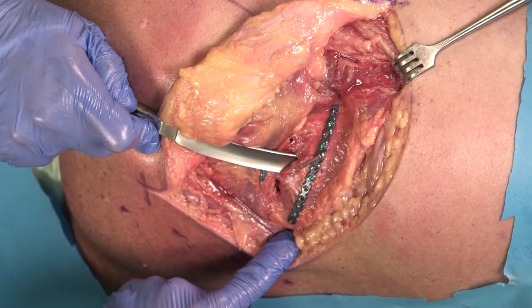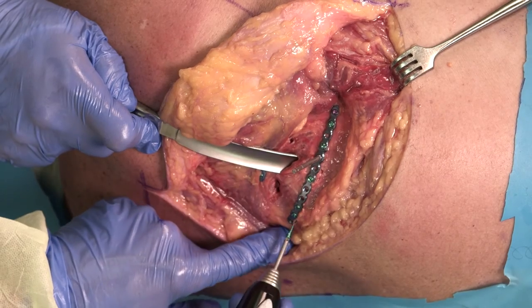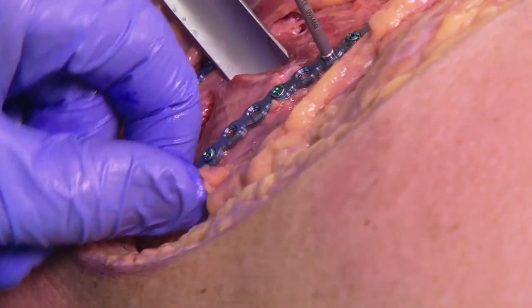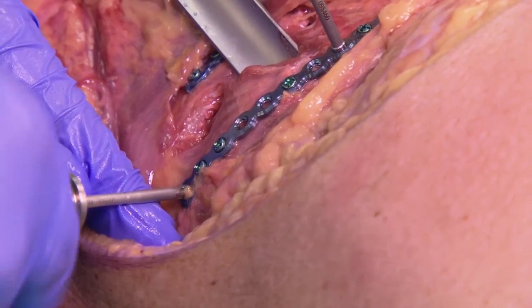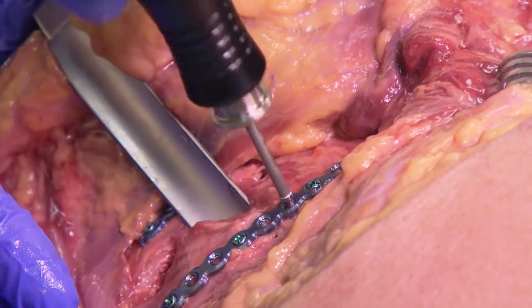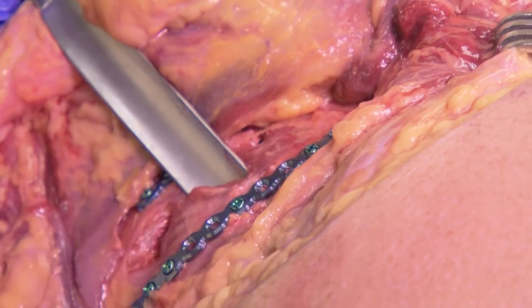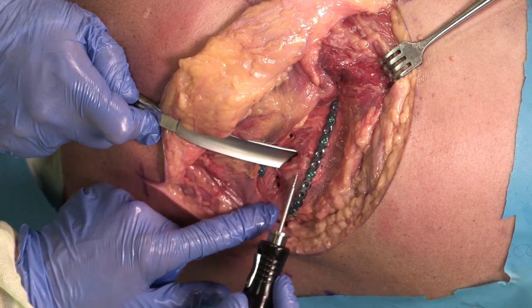A final screw will be placed into the hole. To finish the construct, in this instance with such a long lever arm, three screws will be used in the posterior aspect plus one additional screw to complete the construct. Always complete hand tightening. With any segmental injury, three screws are needed on each side of the fracture. In an instance where the intercalated segment is small, three screws are placed posteriorly, three screws are placed anteriorly, and one single screw placed in that middle or intercalated segment.